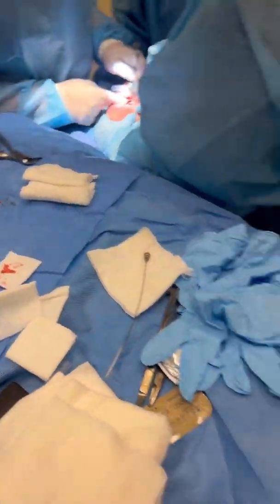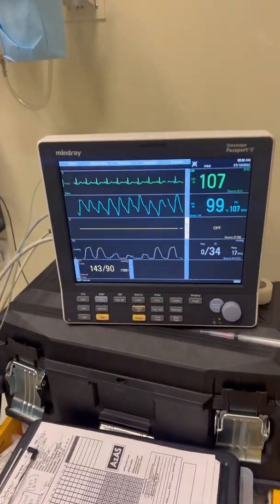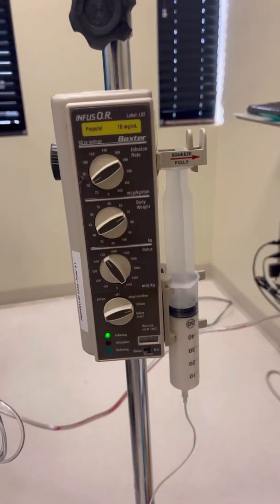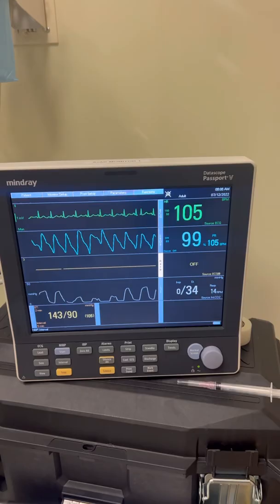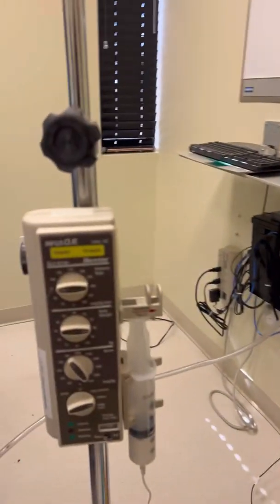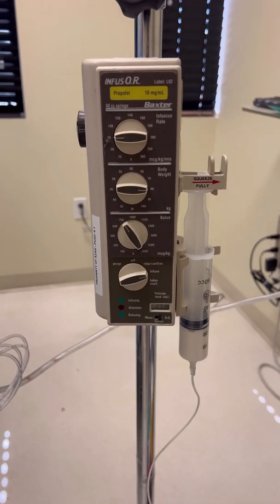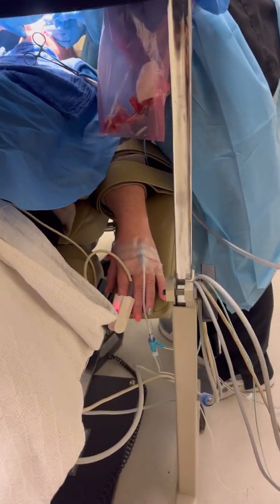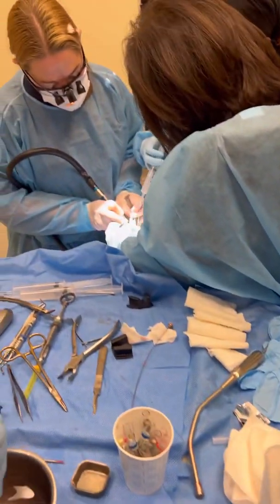A little bonus for you there — pulling out a tooth — coming down to 107. It's just a couple minutes later, all within a five to seven minute timeframe. Got my propofol pump going. Now that's what I like — heart rate came down, blood pressure came down. I have my propofol going at 75 micrograms per kg per minute. Patient is still just hanging out, just cruising.